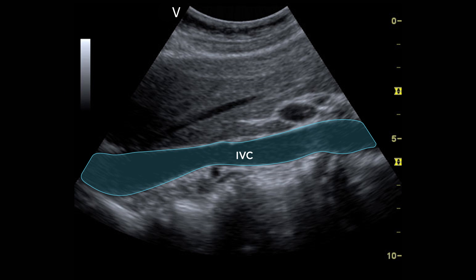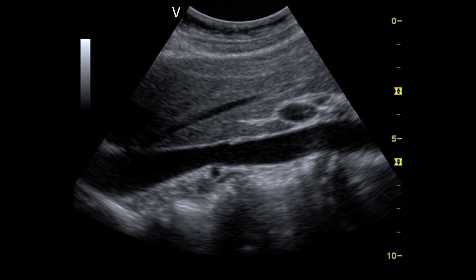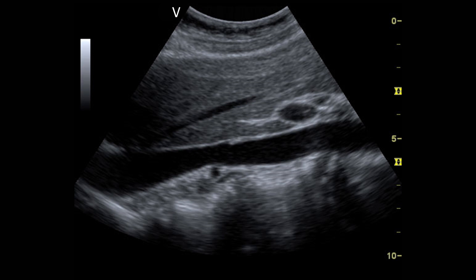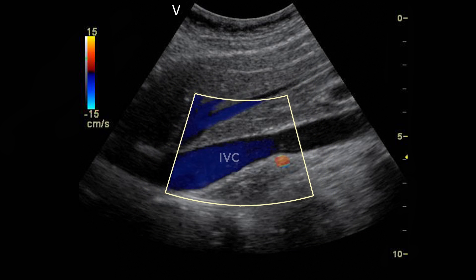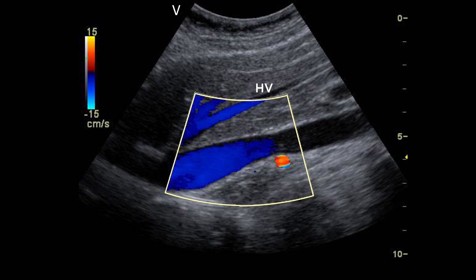Obtain a long axis view of the IVC at the proximal level just below the xiphoid process. In this area, the hepatic vein will be seen draining into the IVC. Activate color flow Doppler and move the color box to the region of the IVC. Flow in the IVC is represented with a blue color. The hepatic veins are also seen in blue, since the blood in the hepatic veins is flowing from the hepatic veins into the IVC.